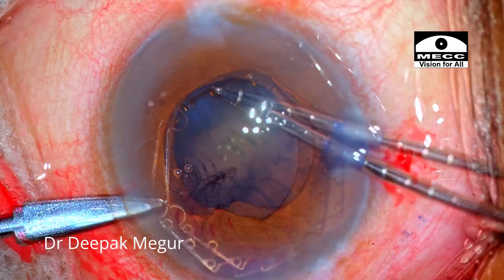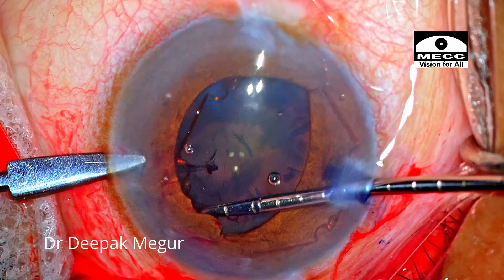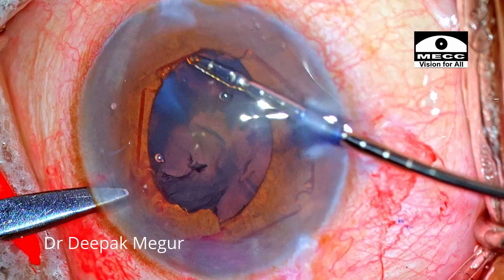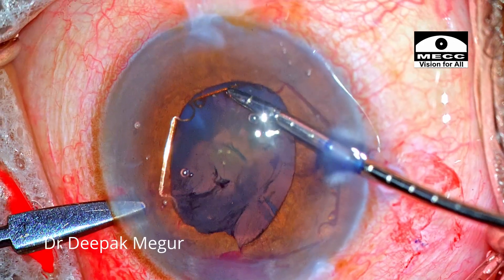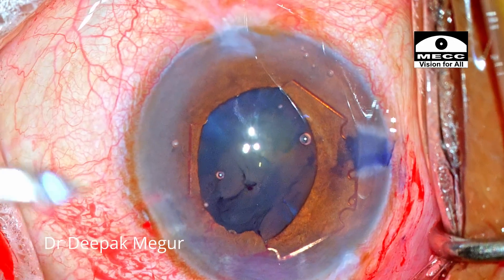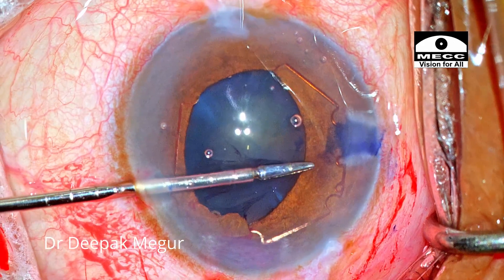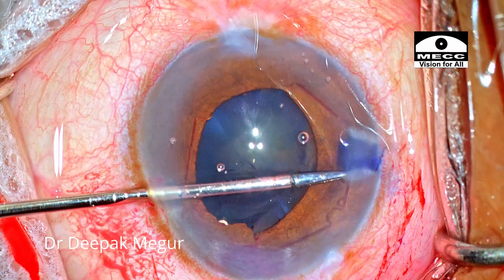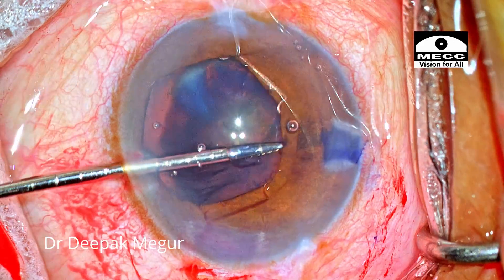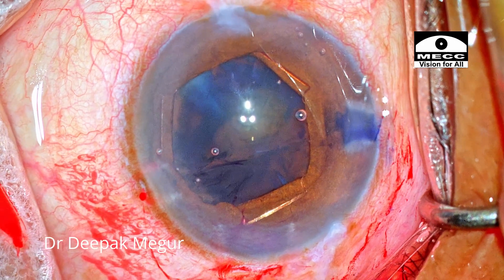Once that is done, time to place the ring. The first notches are placed, but as I try to place the second pair of notches the first pair disengage. I go back and reposition them before attempting the remaining pair. Both notches are engaged, and I switch hands going through the other side port to fix the last pair. Finally the B-hex ring is in place — this gives me enough confidence and solace.